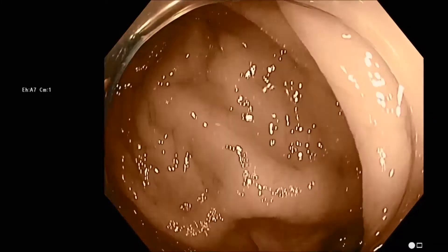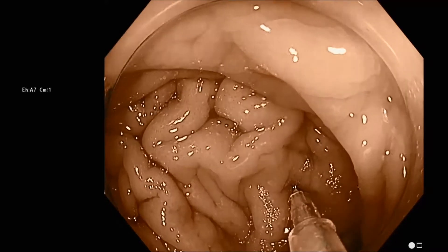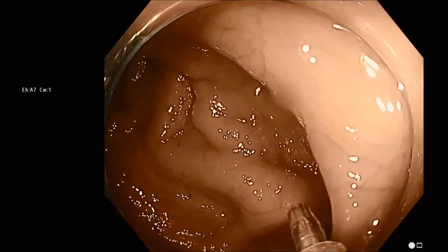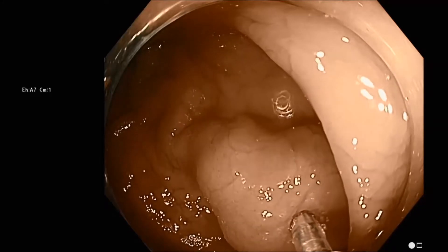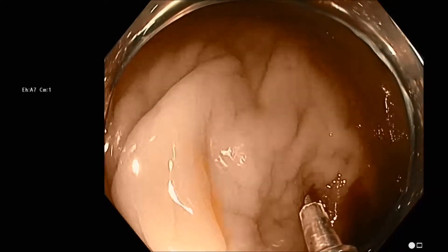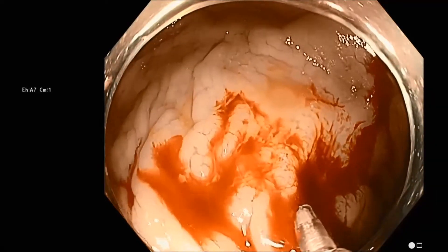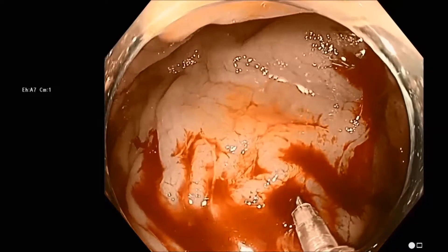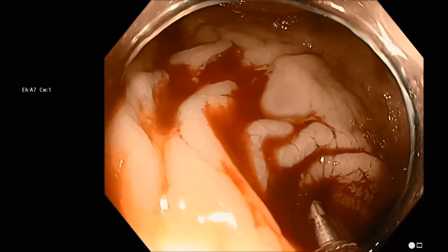The bleb technique here is allowing us to be sure that we're going to get into the submucosal space. Right now we're a little bit en face with our bleb injection. We're using saline here, putting about 1 cc in for each bleb. I like to put all of the saline in first so that when we're finished we can flush the catheter with Spot and start right in putting Spot into each of our saline blebs.